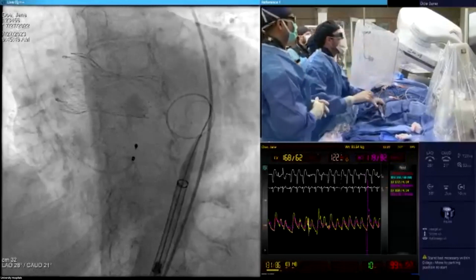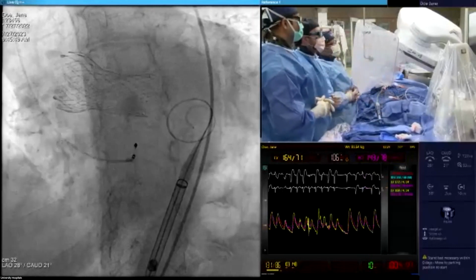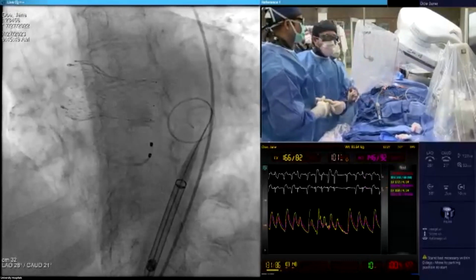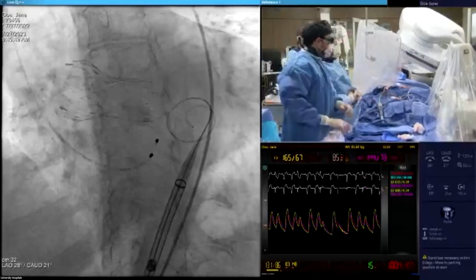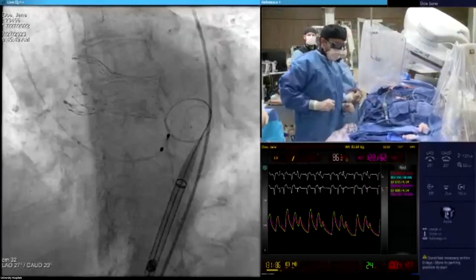How horizontal the aorta is. Look at the... Yeah, exactly. Chris is making a very good point here, guys. Look at how horizontal the aorta is. Can you see there? Yeah, it's very nice, but you saw how you kept it with the wire back, tension released. It stayed on that non-side.